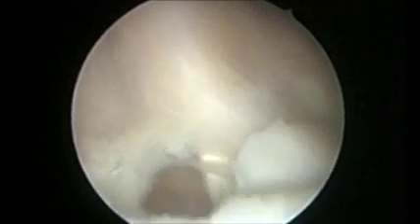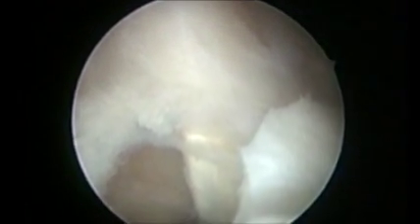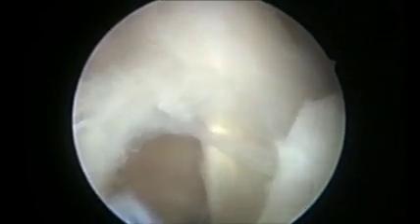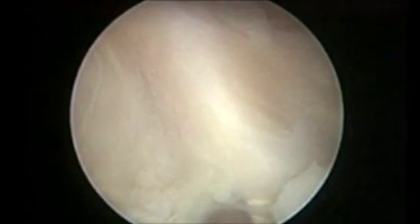Through the opening, one can often see the medial head of gastrocnemius tendon, as the cyst wall is usually posterior and medial to the medial head of gastrocnemius. The motorized shaver is inserted into the popliteal cyst, and the cyst wall is gradually and gently abraded, taking care not to use vigorous suction because that can cause inadvertent damage to the neurovascular structures in the posterior knee compartment.